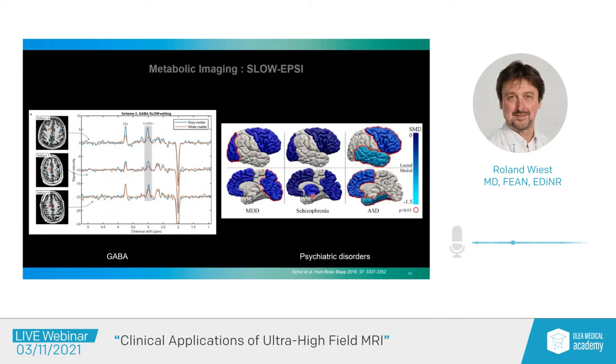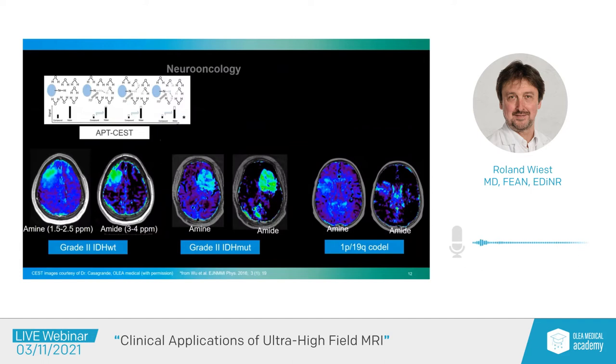I would then briefly touch on the method of chemical exchange saturation transfer. This is a non-invasive method that provides information about metabolites and proteins that have protons that exchange with the water pool, an amide proton transfer. And this is particularly the work also of Olea.